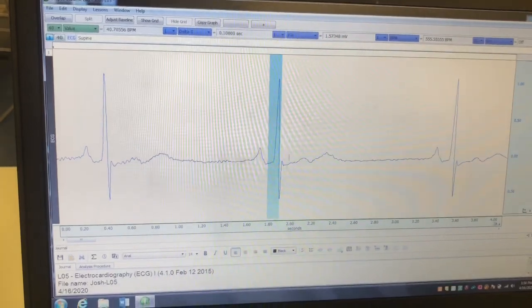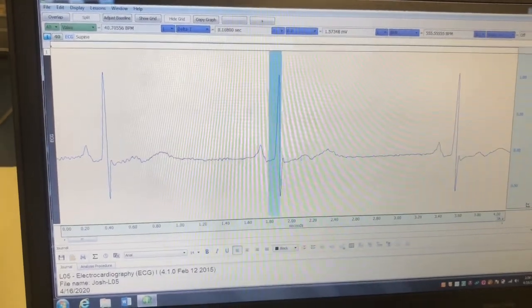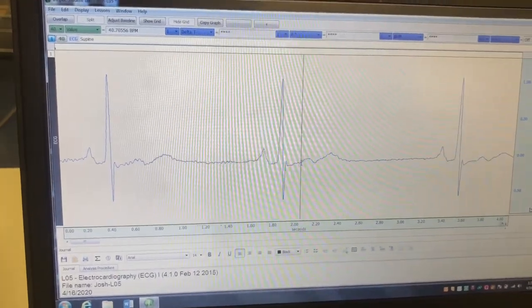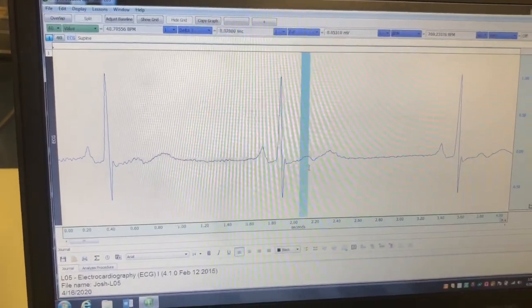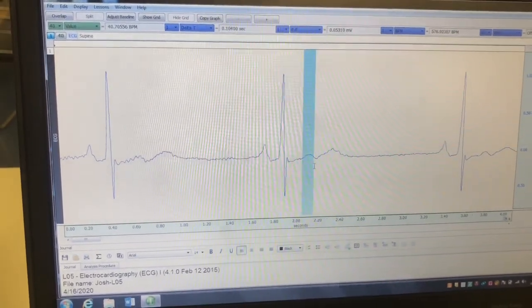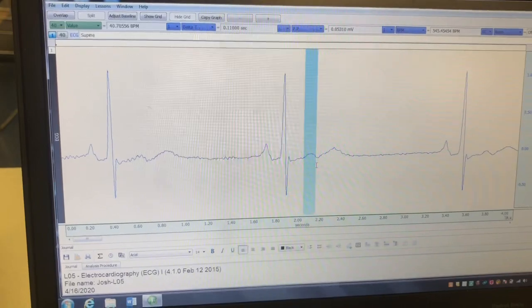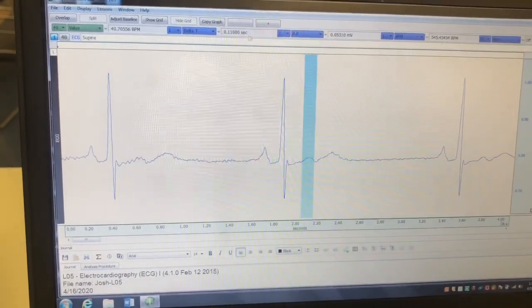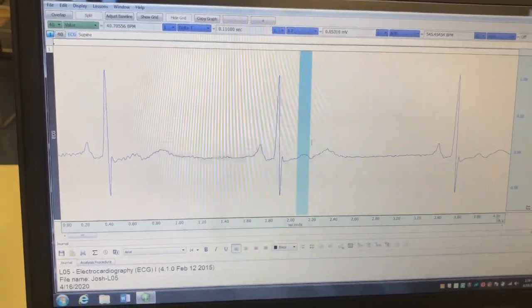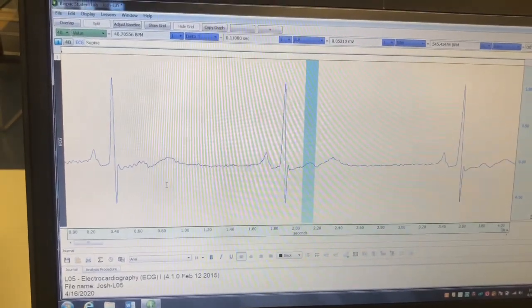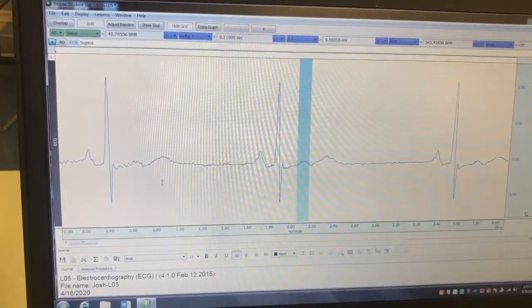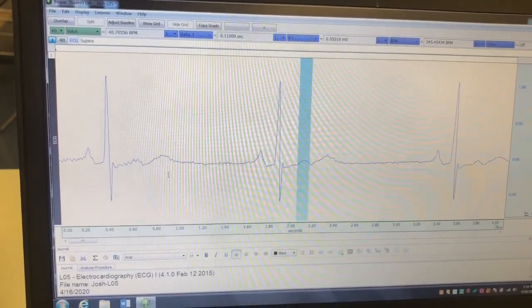Next is your T wave, right here. You're going to go from the beginning of that to right about the end, and again record the time and amplitude.